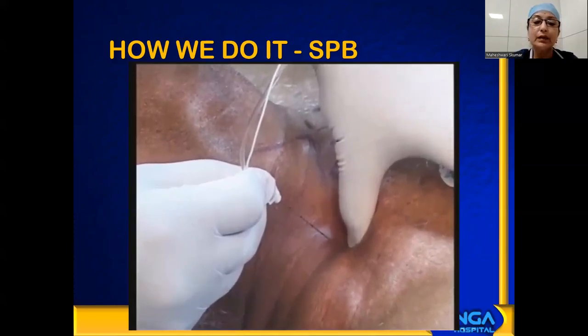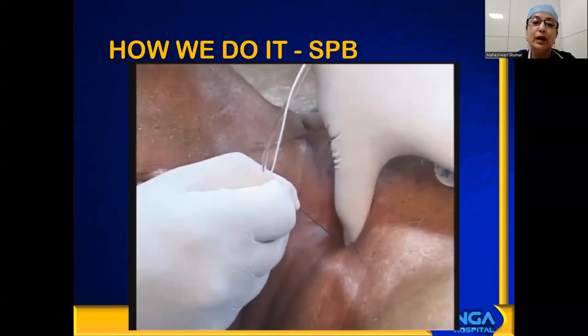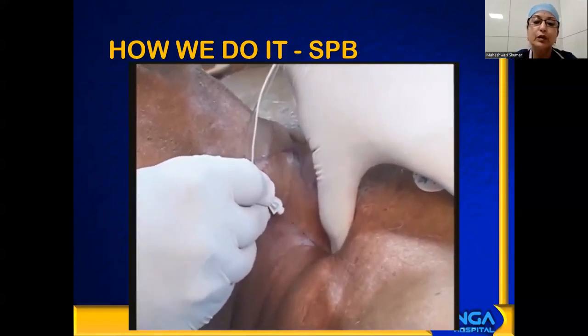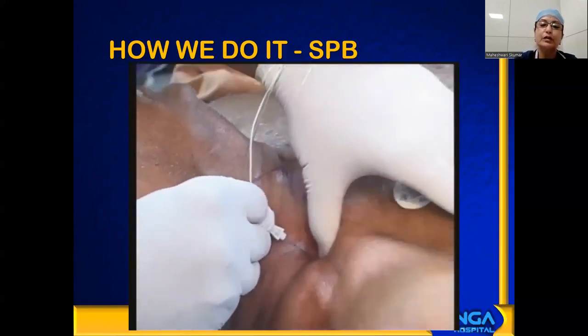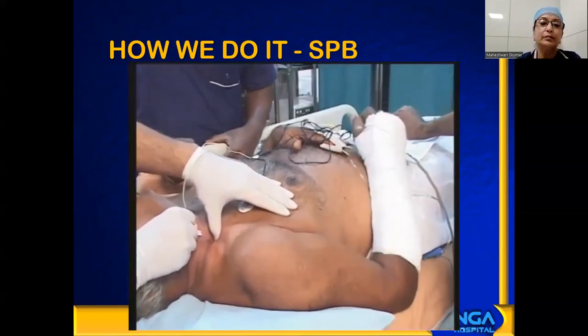And once the needle is inserted, you get the end motor response. And here you will see extension of the arm, which is the posterior cord response and which is the best response. You accept this response, reduce the current, and we inject the drug.